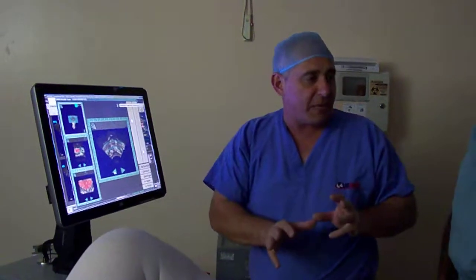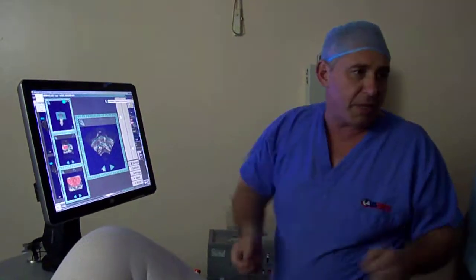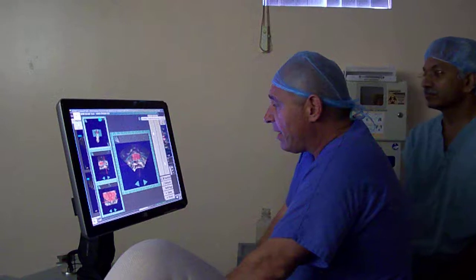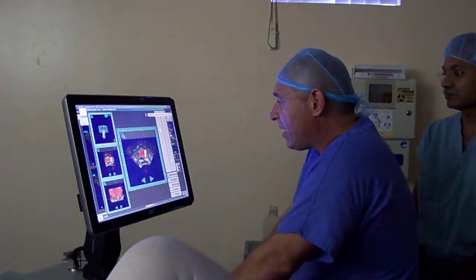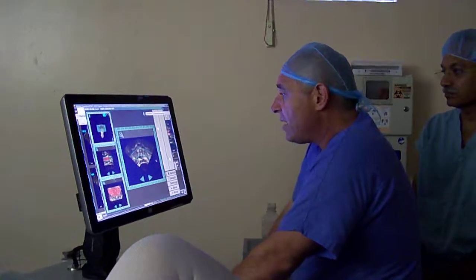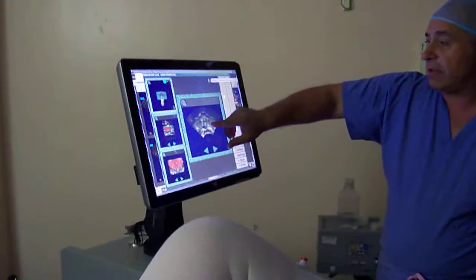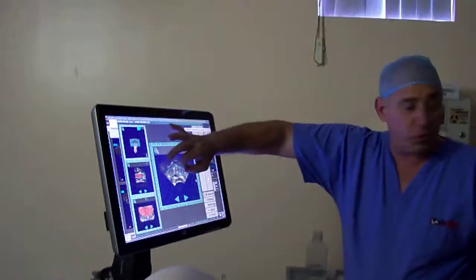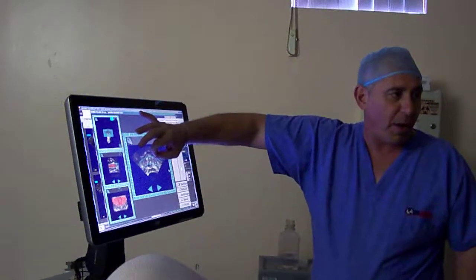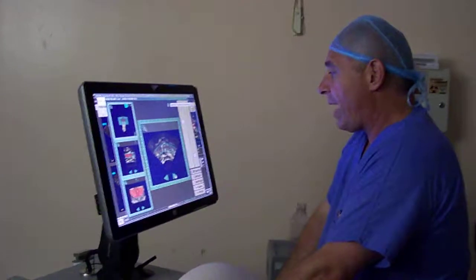The significance of that is, if we put energy onto the membranous urethra, that's a very high risk of stricture, which, like everything else in urology, is something to worry about. But here, this is probably going to be just a little aggressive. In fact, if I took these away, now look at the image. Urethra, look at this. Levators, that's truly the apex of the prostate. So when I see that image, I try to keep energy off that spot.